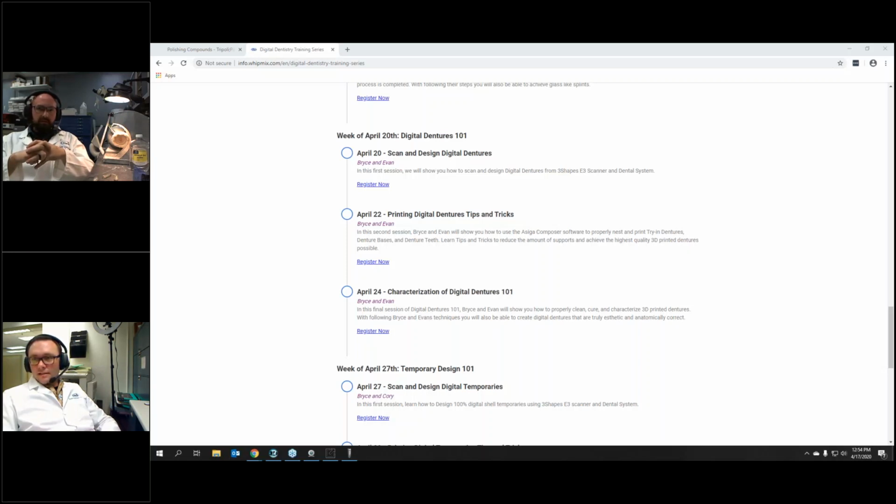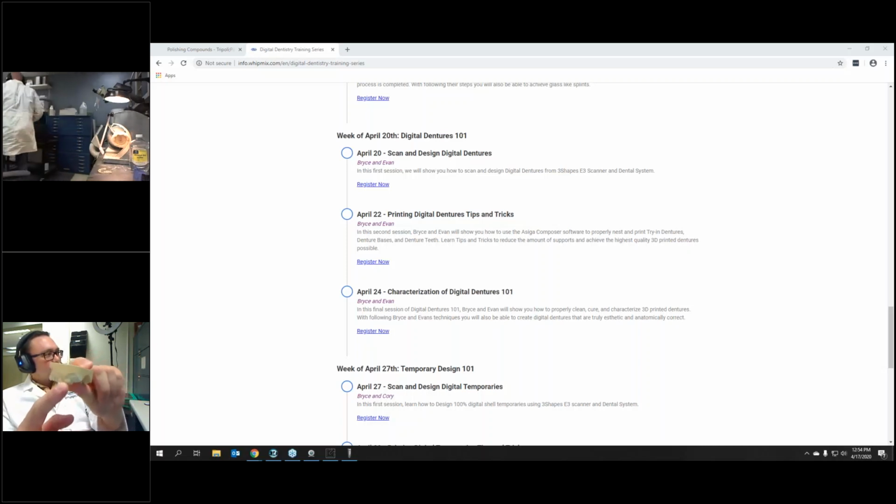And we had another one from Ben. Do you have a model to check the fit? So we do have a model. I can run it over to Cory. I do have to make one adjustment. If you've been with us through the whole time, there was a pull that I adjusted in the software. And if I don't remove that on the model, then of course we're going to have a little fit issue. So let me go take that off and then give it to Cory.